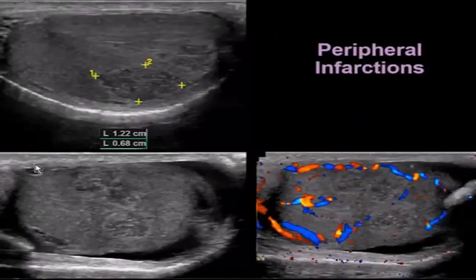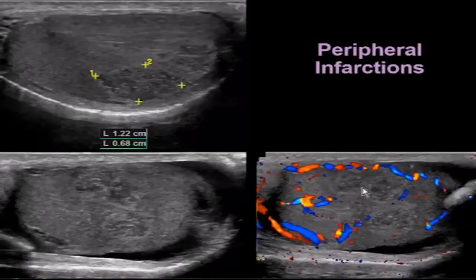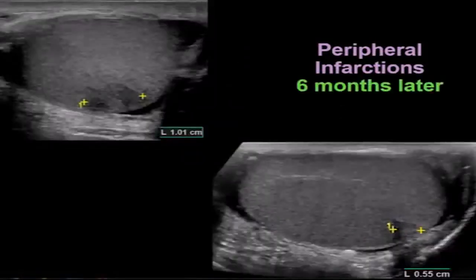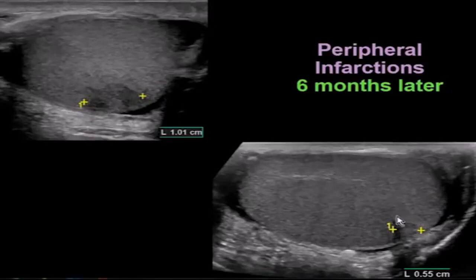This patient presented with pain and had peripheral lesions with no blood flow to them. The diagnosis was thought to represent an infarction, so these lesions were followed. Six months later, they're much smaller — resolving peripheral infarctions. We still see a residual hypoechoic lesion extending to the periphery, and in one view it is wedge-shaped.